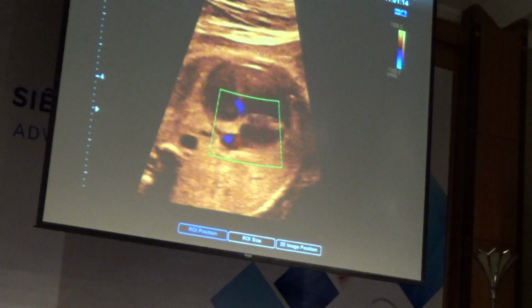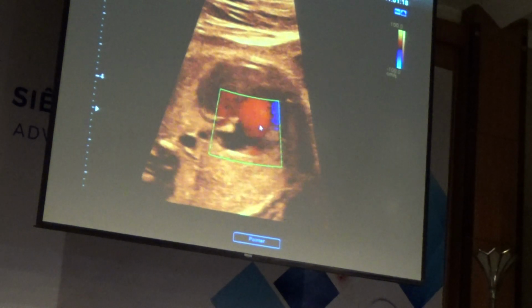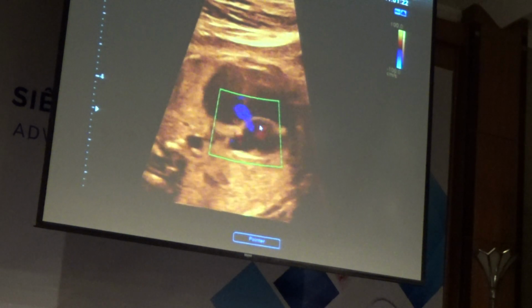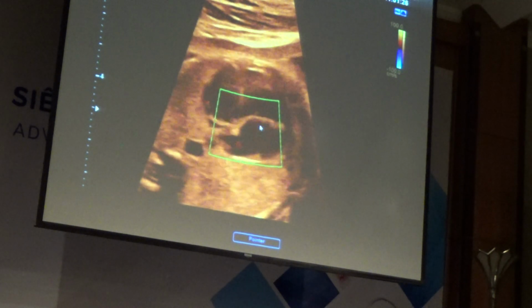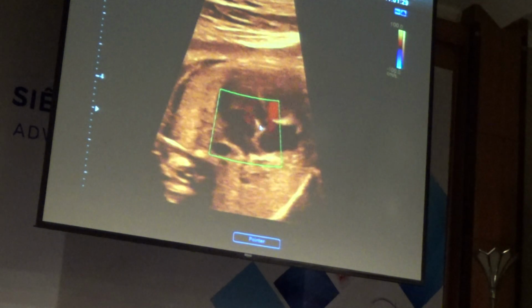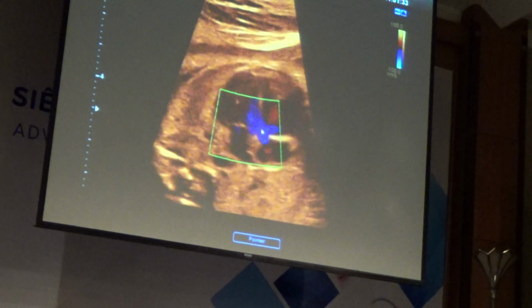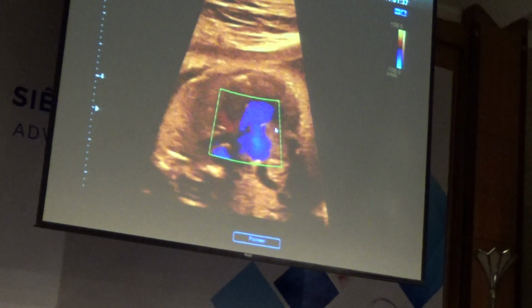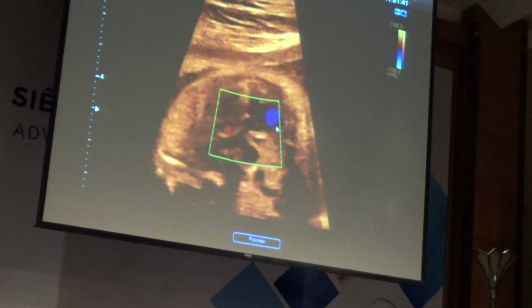You can see a little bit more tricuspid regurgitation. But I'll drop it down a little bit. But there looks like there's trace to mild tricuspid regurg. It's usually normal. And I'm looking at the left ventricular tract. There's no regurg. And sweeping to the right ventricular tract.